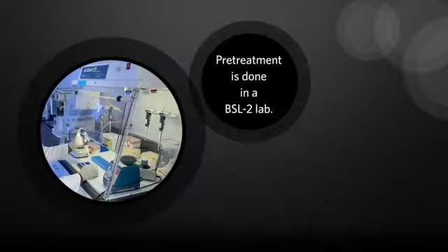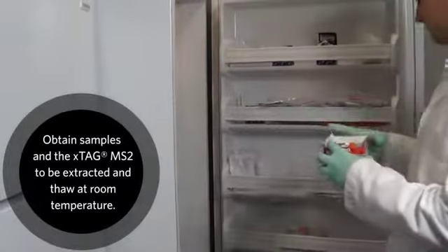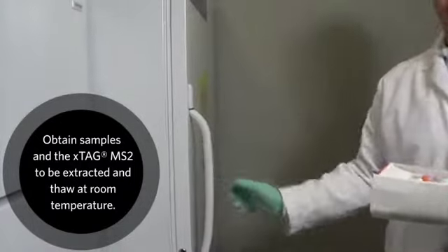Pretreatment is done in a biosafety level 2 or BSL2 lab. Prepare the BSL2 hood for use as per your lab's standard operating procedure. Obtain samples and the xTAG MS2 to be extracted and thaw at room temperature.